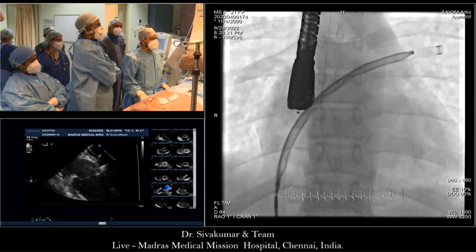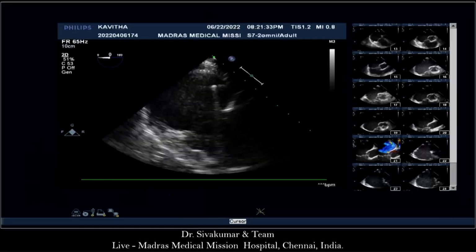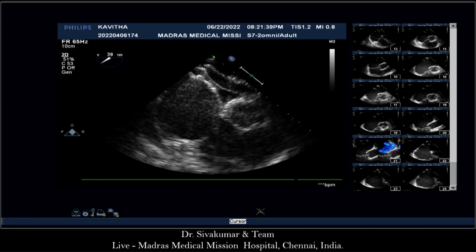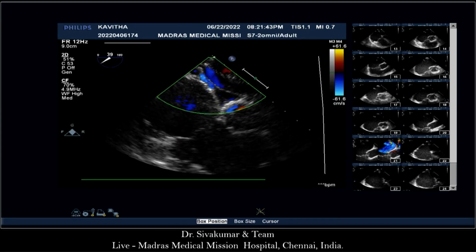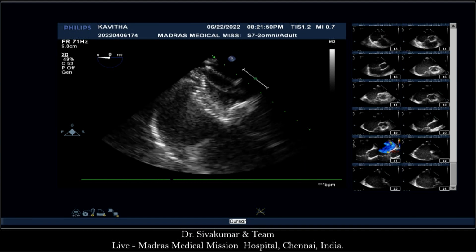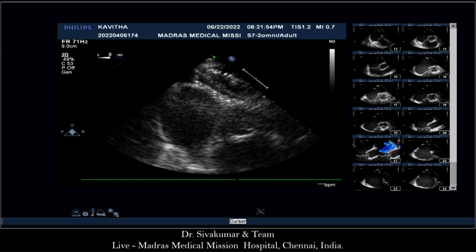Srija, show me good echoes. Echo big. So pull it out to 0 degree. Come out to superior vena cava and go in progressively down. Yeah. Now go to 0 degree. No, the image is not right. Okay. Now pull it out fully. Show me the superior vena cava. Super. Now that's aorta and superior vena cava. Yeah, it's slowly going in.